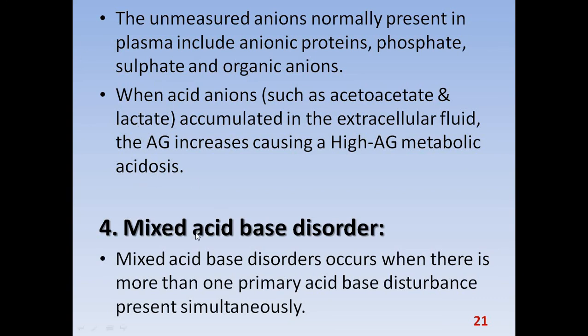Now the next one is mixed disorder. Mixed disorder occurs when there is more than one primary acid-base disturbance present simultaneously.